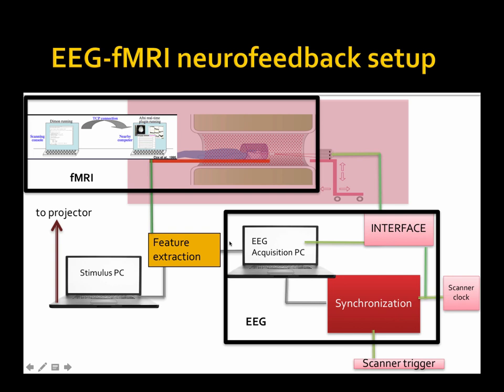That will be not only extracting the feature, but also finding a common space for these things. Remember, the time resolution and the space resolution of both are different. So you will need to figure out what features to combine and then project it back to the subject.